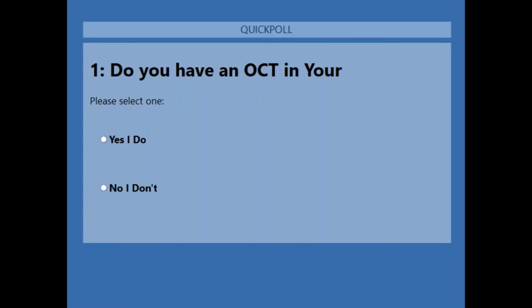I tell you, 8, 9 years ago, it was probably about 30% did, 70% didn't, maybe 40% did, 60% didn't. It was more didn't than did. And as we went through 2018, 19, 20, 21, now into late 2022, it's amazing to see where this percentage has went. Again, so do you have an OCT in your office? Yes, I do, or no, I don't.